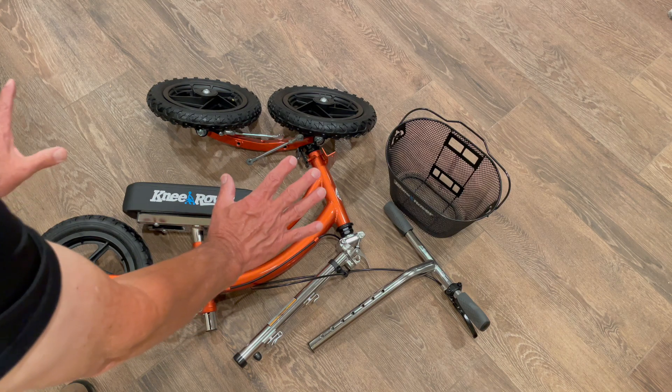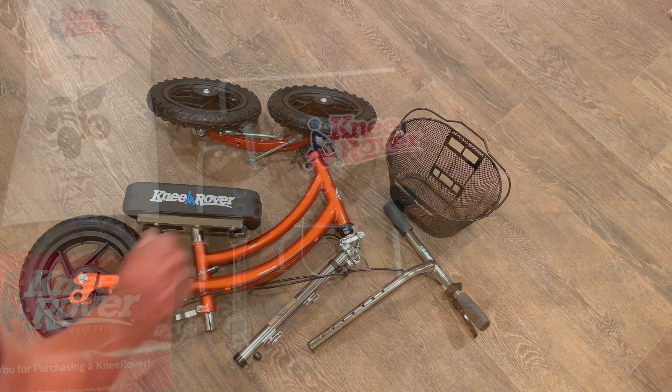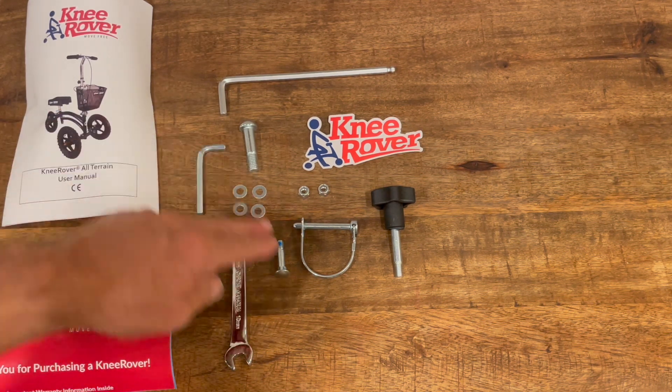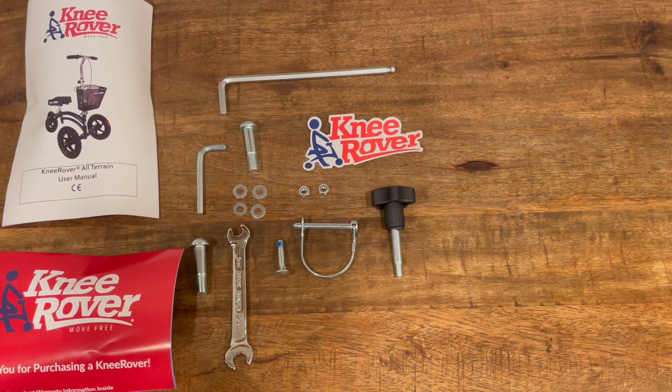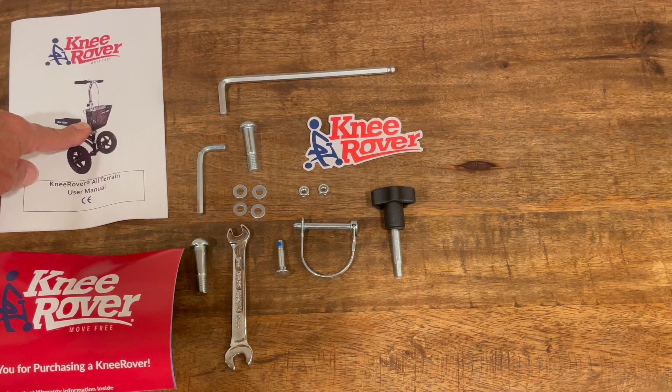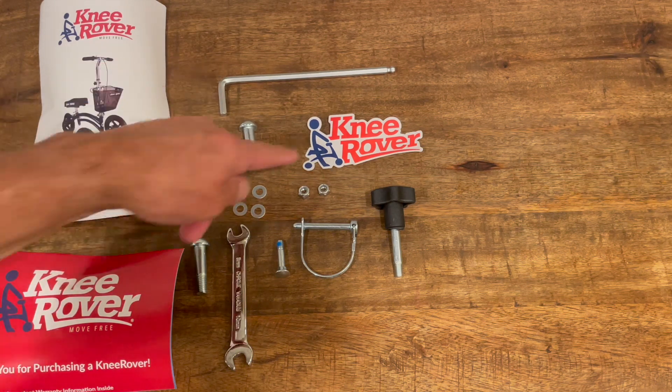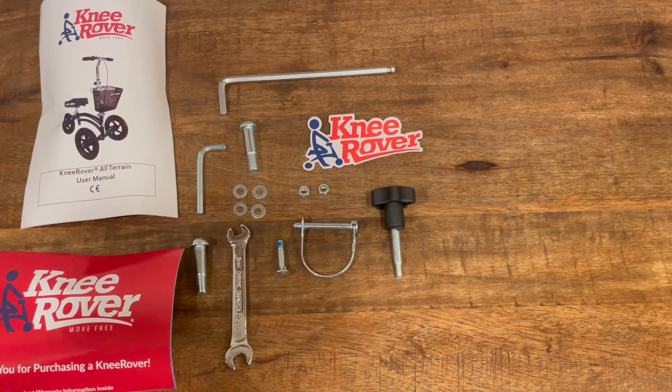This seat is put in upside down for shipping. I like to lay all the parts out like I've done here so you can see individual parts, and they will be named later inside the book. This booklet will give you step-by-step instructions, but sometimes I'm a visual person, and a video like this is nice to have.